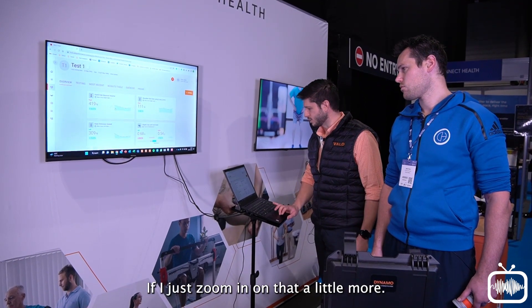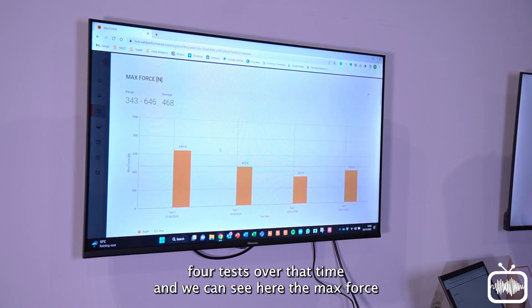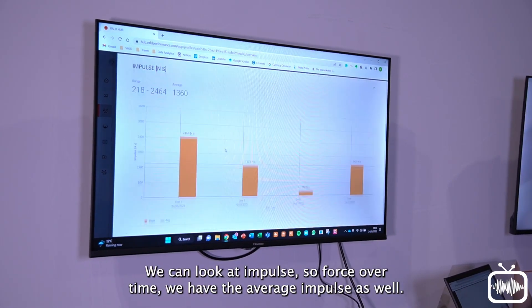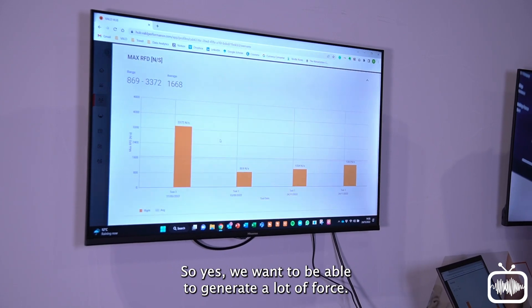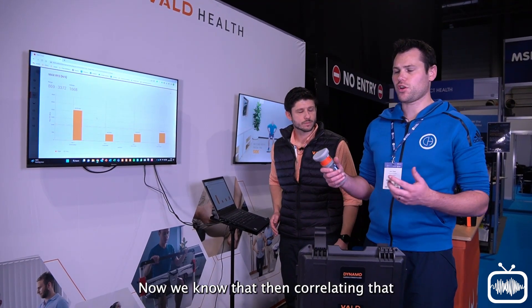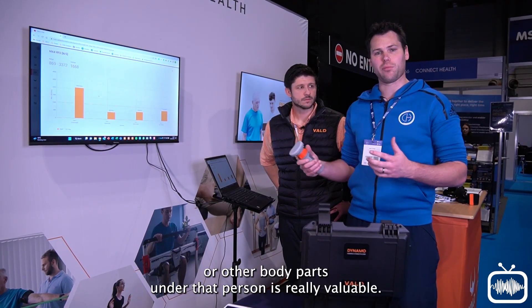For the hand grip strength, if I zoom in a little more, I can jump into more detail — four tests over that time — and see the max force, then progress through to different metrics in the system. We might want to look at average force across those reps, we can look at impulse — force over time — average impulse, and then rate of force development, or RFD: not just how much force we can generate, but how quickly. VALDhub allows us to take those maximum measures and really dig into them in more detail, as well as correlating with other clinical tests or other body parts under that same person.